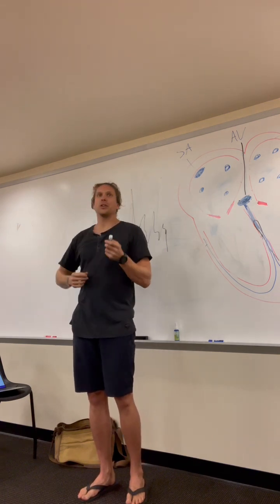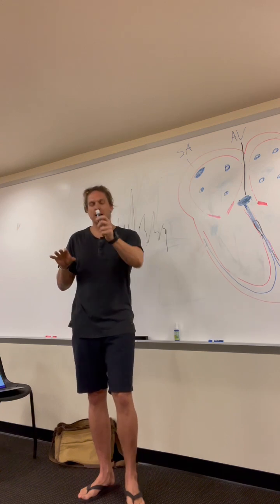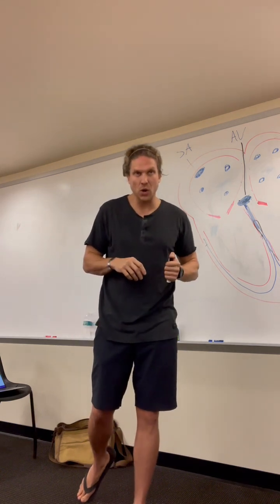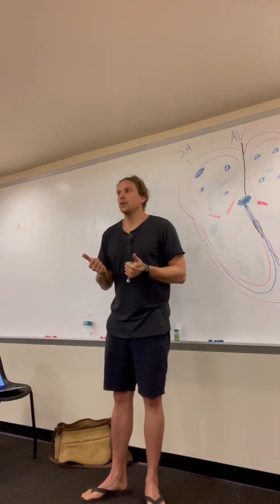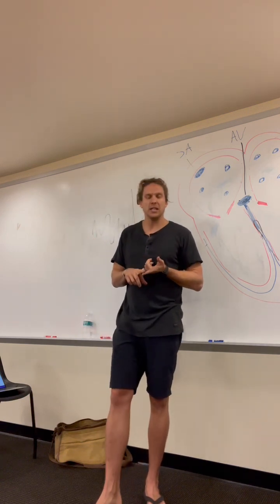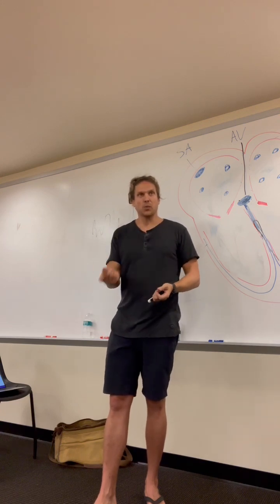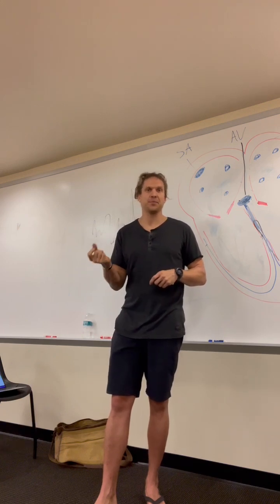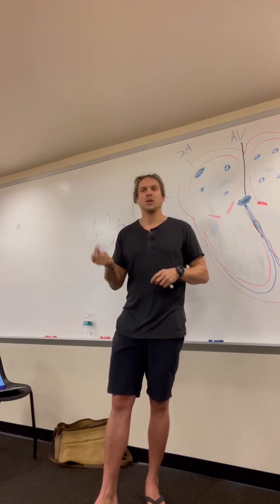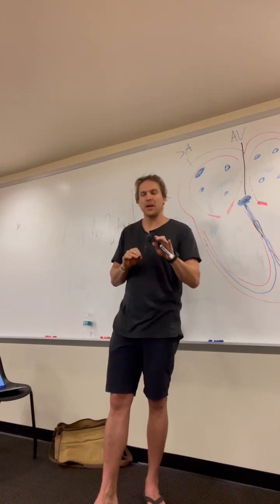She talks about regular and irregular. So, when discussing regular and irregular, we already learned that in health assessment. When you take a pulse, this is a regular rhythm, and then this would be an irregular rhythm.